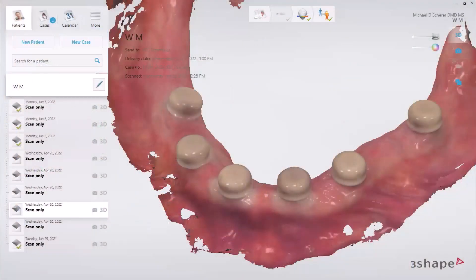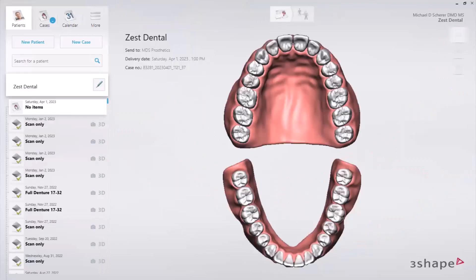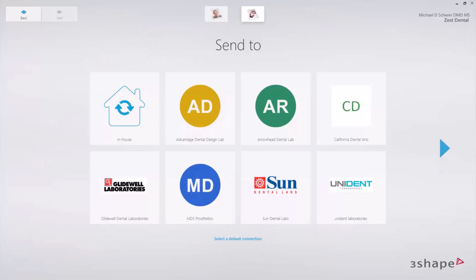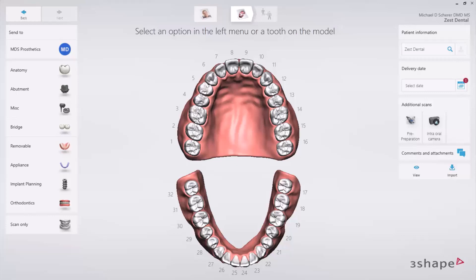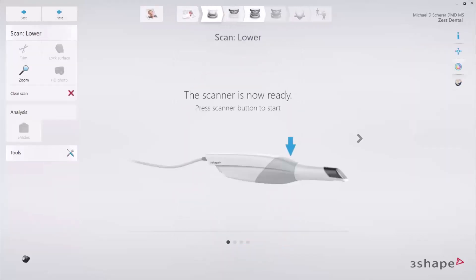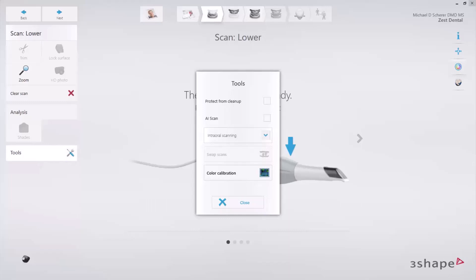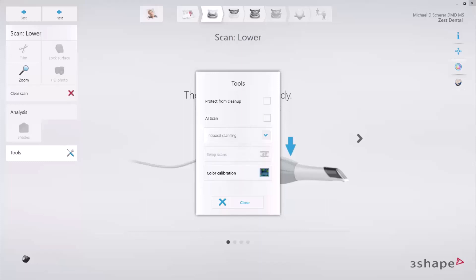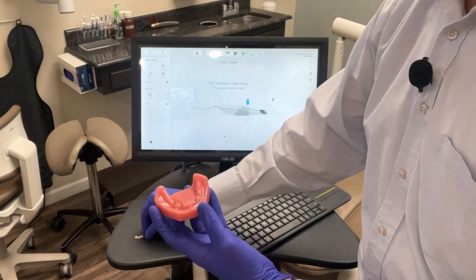The first step is we're going to open up a new case file for our patient — I'll open up a Zest patient here and create a new case. I'm going to choose my own internal laboratory. For this workflow, we'll use either status scan or scan only, depending on what version of TRIOS you have. I'm clicking on the scan function to open up my TRIOS intraoral scanner page. First thing I like to do is click on tools and turn AI scan off, then make sure I'm on intraoral scanning or intraoral edentulous scanning.